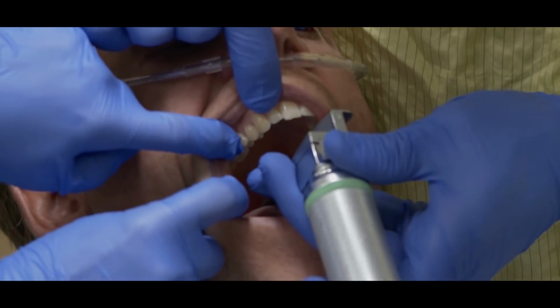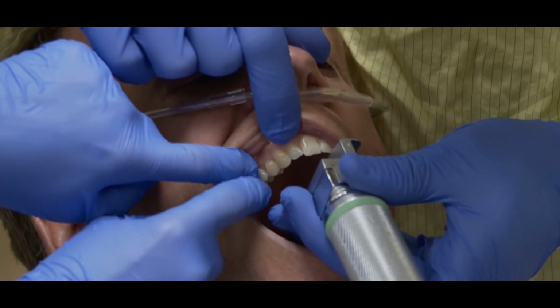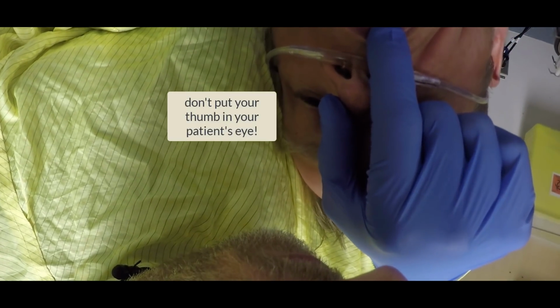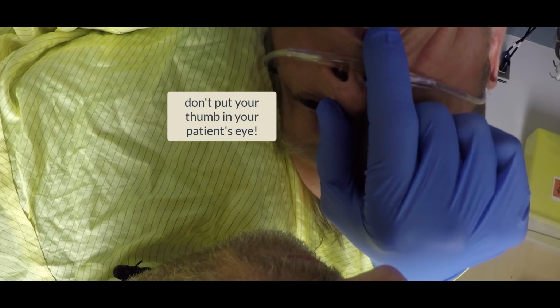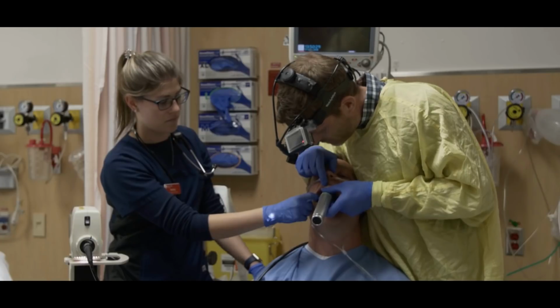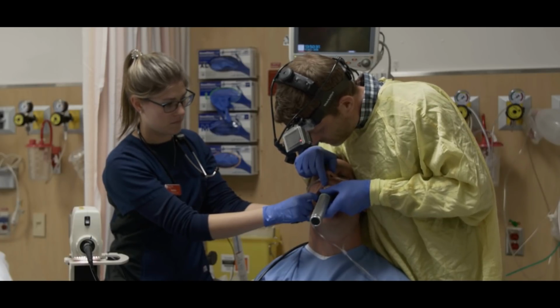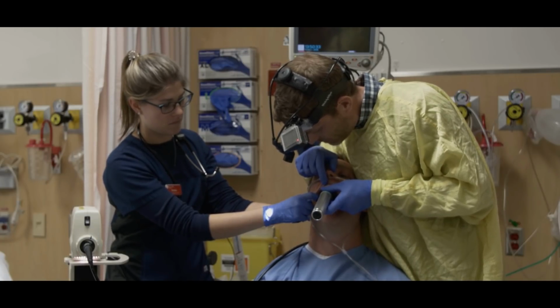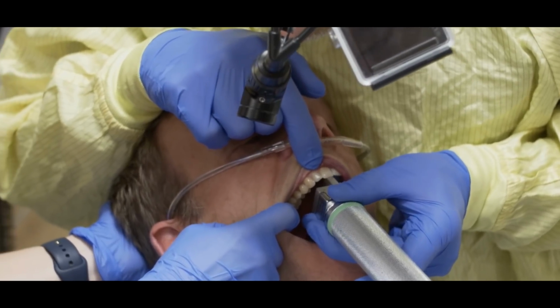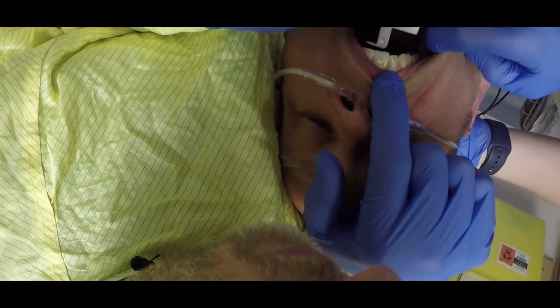Putting a pretty good pressure on there, and Chad's tolerating this okay. Just small movements. Yeah, see that on the teeth?